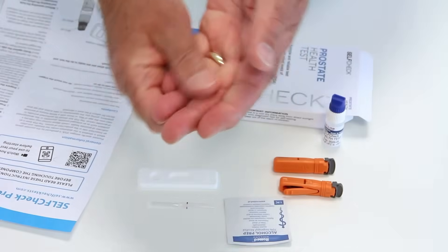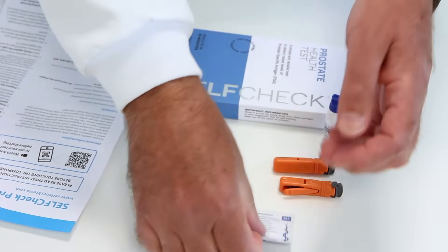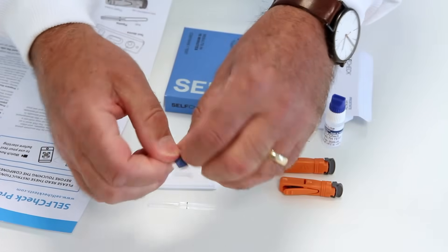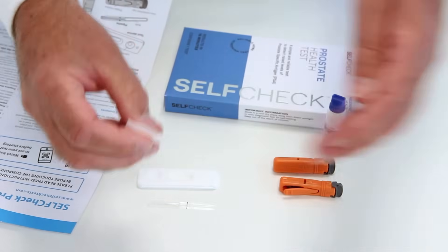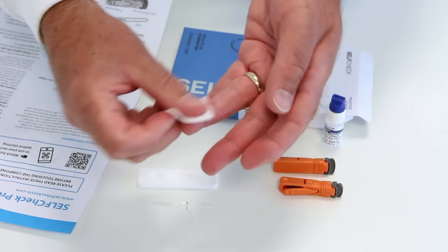Hold your hand below waist height and gently massage the middle or ring finger. This increases the blood flow. Wipe your finger with the alcohol swab, then allow your finger to dry for a few moments.